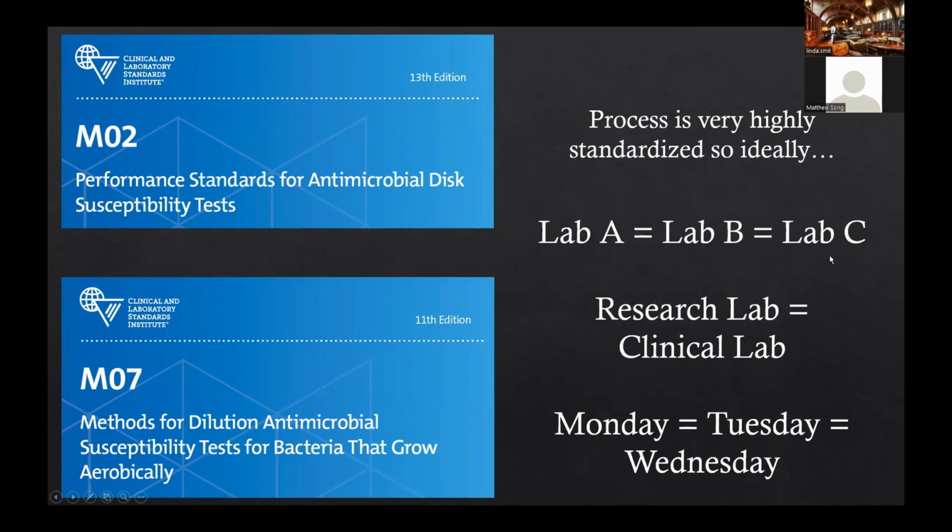We all come up with the same answers. We all want to be consistent with what we're saying here. We want it so that if a research lab, especially research labs that are developing these tests and developing new drugs, does a test, they should get the same result that a clinical lab does. And ideally, if I do the test today and tomorrow and the next day, we want it to be consistent over time, as long as the bug doesn't change. So it's very highly standardized. We do the same method here that they do in Berlin, or in Buenos Aires. It's the same process, so that we should be consistent.